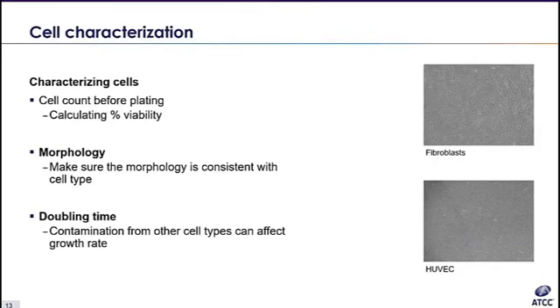As we leave the discussion on cryopreservation, I want to discuss cell characterization as it relates to our upcoming topic of general cell health, contamination, and authentication. It is necessary to characterize cells to determine how healthy and viable they are, as well as making sure that they are the cells you think they are.